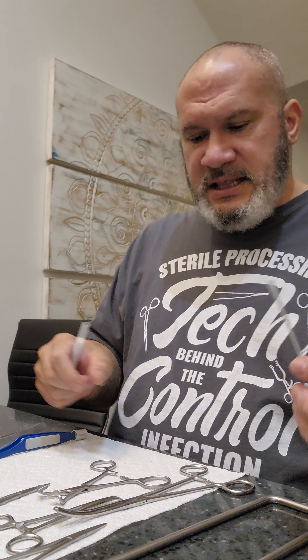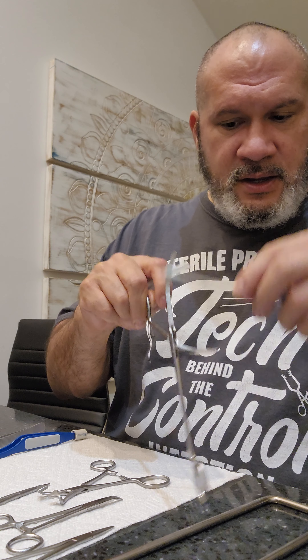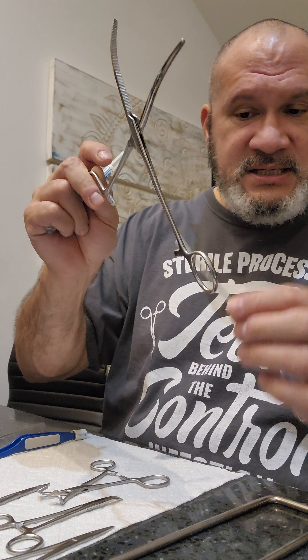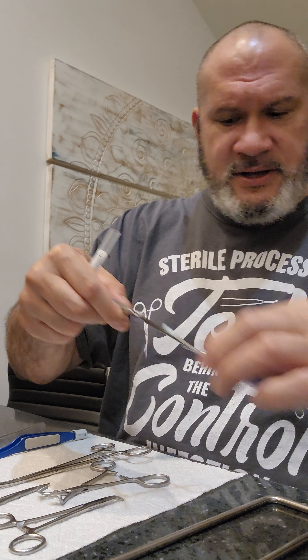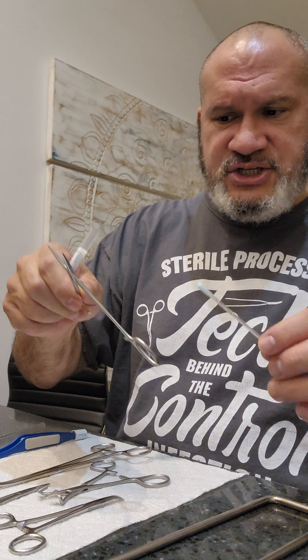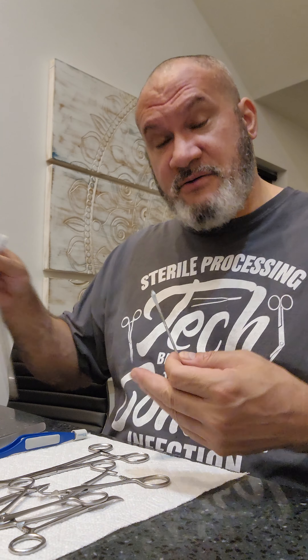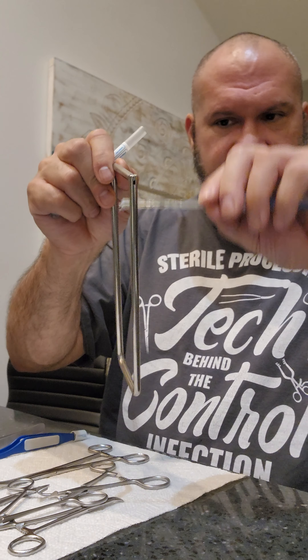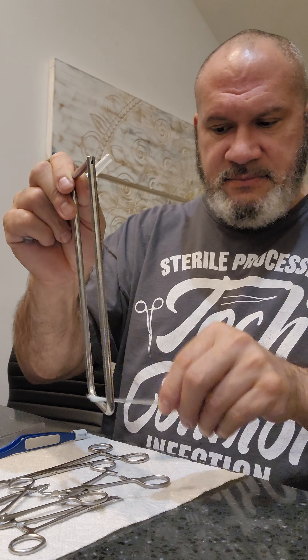For your clamps, you want to get that jaw, the box lock on both sides. Get down to the shaft, around the rings, and get that ratchet. If you have several clamps, do a couple different ones — get that jaw, box lock, around the shaft, the ring, the ratchet. And don't forget your stringer — cleaning verification is for everything. If you have a basket, you want to swab the basket as well. Go ahead and grab your stringer because this has to go through the cleaning process too. Make sure you're not swabbing where you're touching with bare hands — wear gloves.